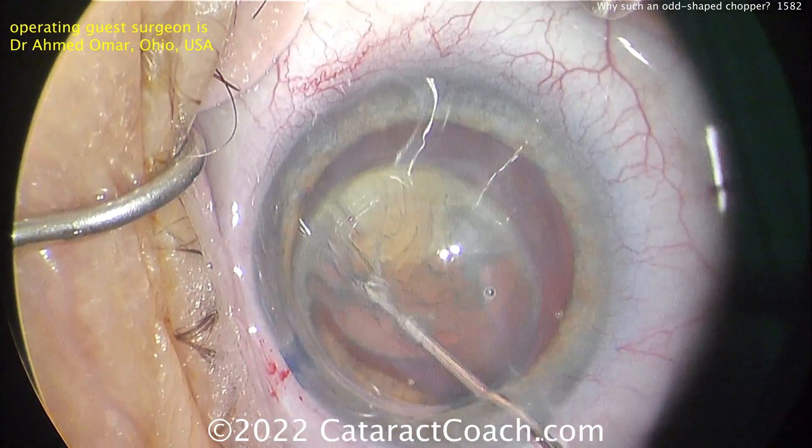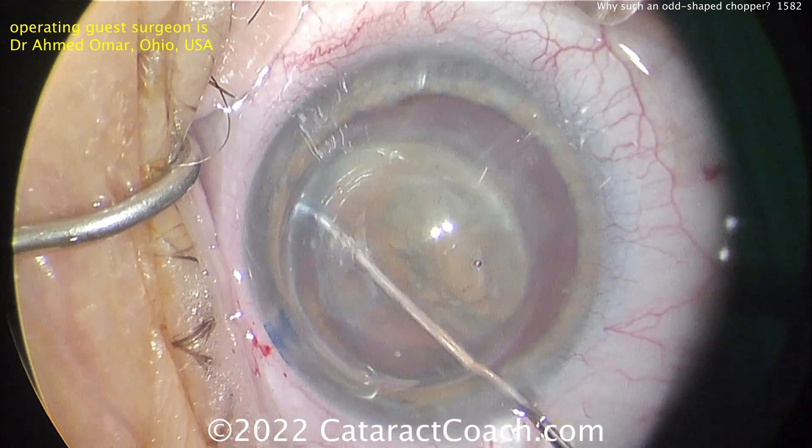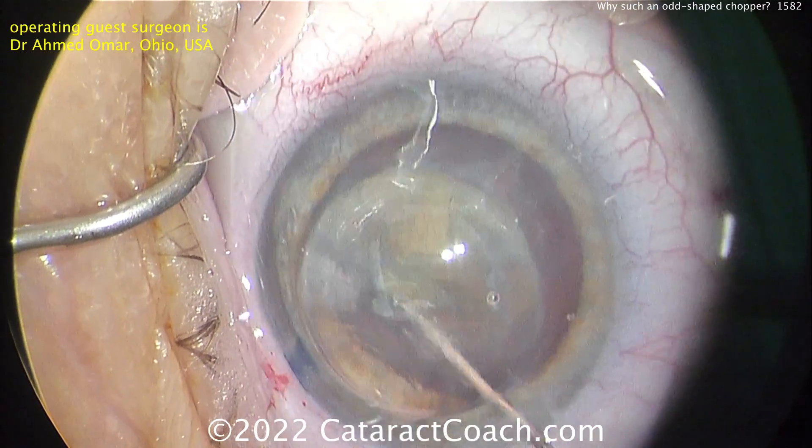Fortunately, this patient's central cornea is pretty reasonable. It's clear, with a reasonable endothelial cell count and not much distortion. And so the patient was seeing well because the central cornea is pretty good.